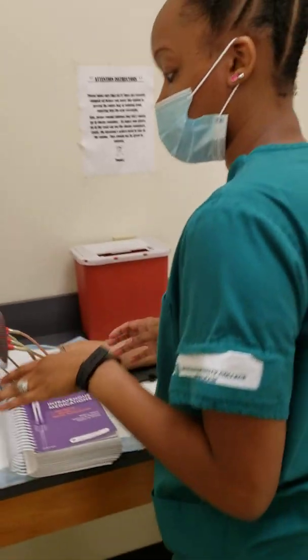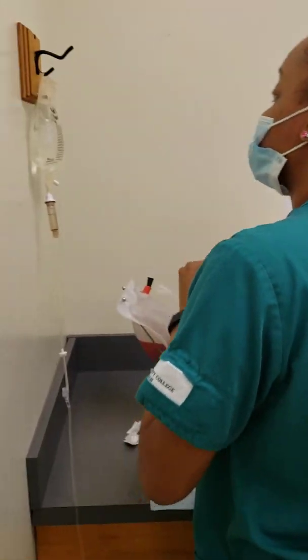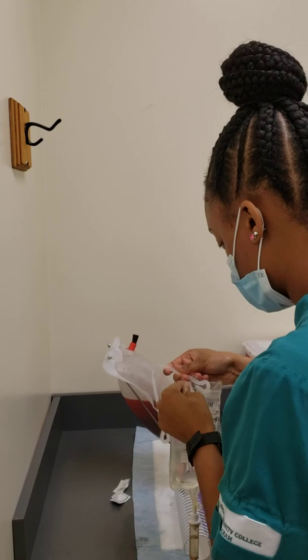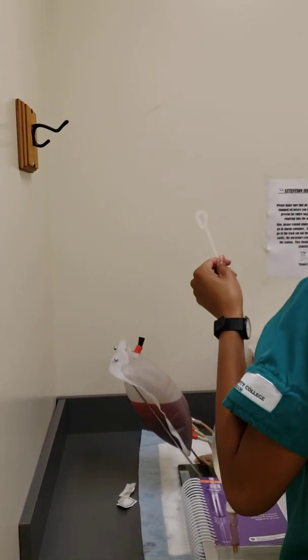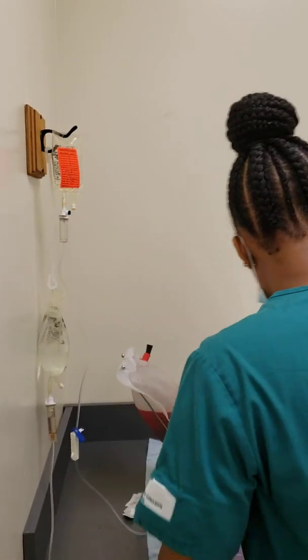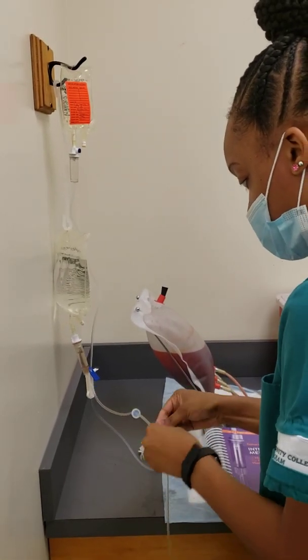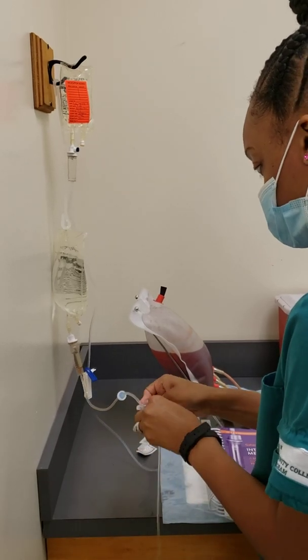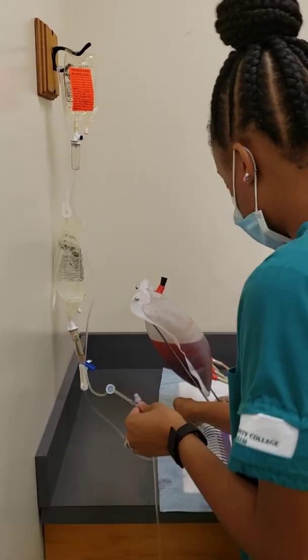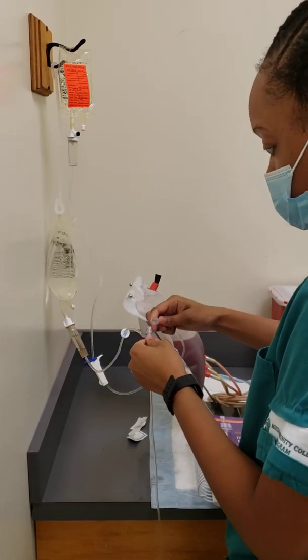Okay, so what I'm gonna do now is we're gonna lower my primary bag. And we're going to hang the secondary. Okay. And we're gonna clean the port that's closest to the patient for about 15 seconds. I'm sorry, closest to the bag. Clean the port closest to the bag. Okay. I'm gonna go ahead and insert this.